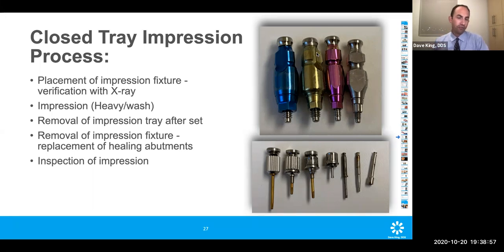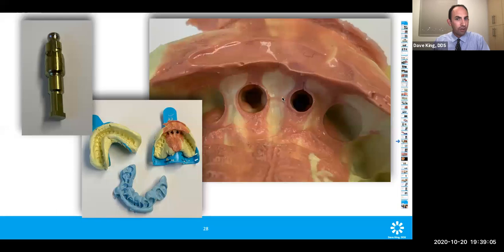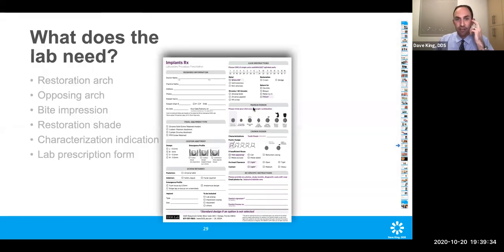And I've got a case here I'll show you in a little bit where we use the same implant platform size, but different widths of impression copings. So inspect those impressions. And so here's that case. I don't remember the exact width, but this is a regular platform impression coping here. And there was the same regular platform, but a narrower impression coping there. So this was a great example of two different sizes of the same implant platform. But inspect those impressions, depending on what you got going on, you want to make sure you have adequate detail before moving on to the next step, especially so we don't waste our time and the patient's time.